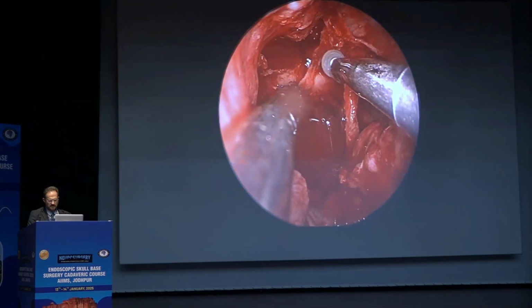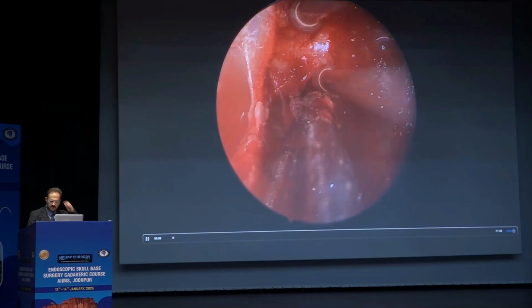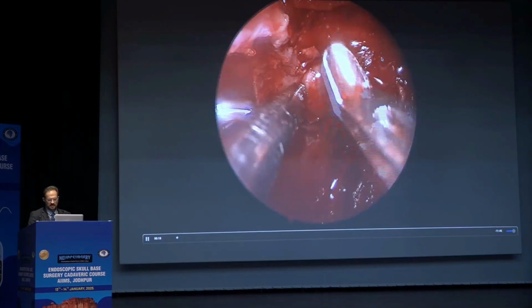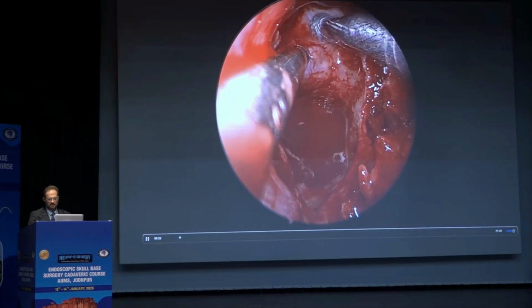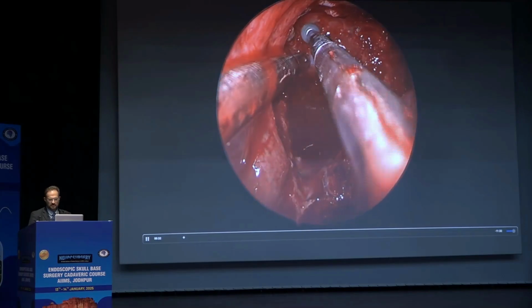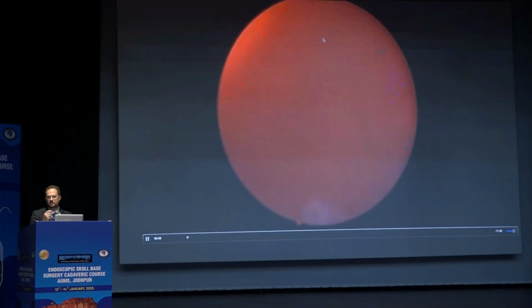Here's one of my own. This is my own situation here. This was a meningioma on the other side. And this was crazy because I was running two rooms and I was doing a pituitary in one room. I came to the room, exposed this side. The tumor was right there. And we didn't expose the right side of the nose because I thought we were just going to go there. But I was in the other room and my fellow decided to open a little further on the right. And although we were dealing with a decompression on the meningioma in that area, on the left optic nerve, he decided to drill blindly here. I don't understand to this day why he came here. And it drilled into the carotid artery.